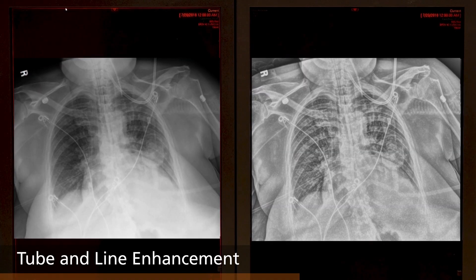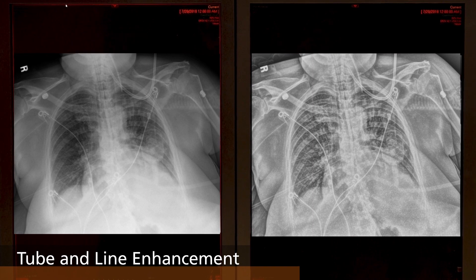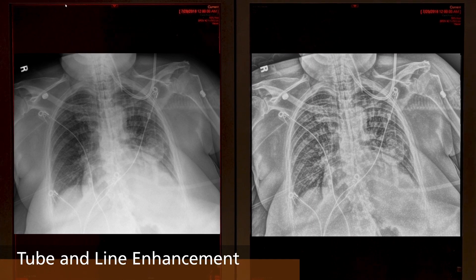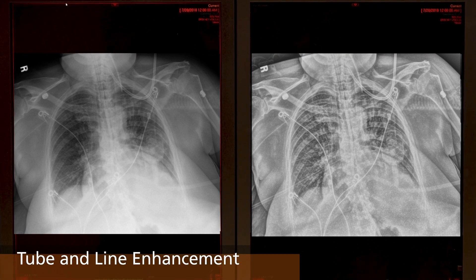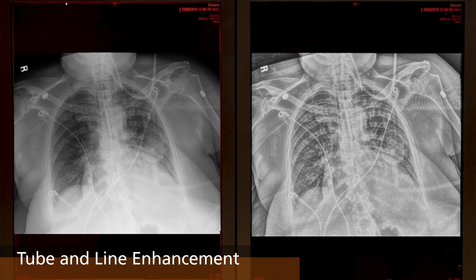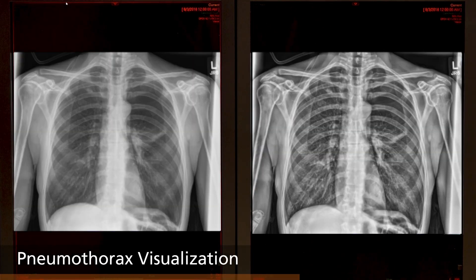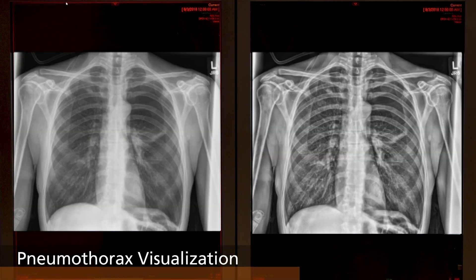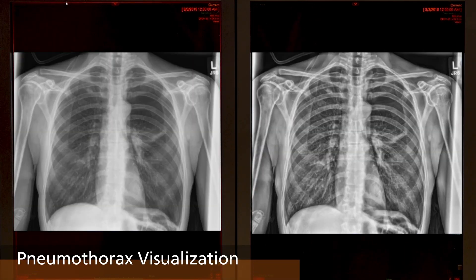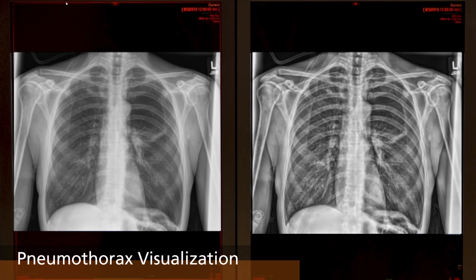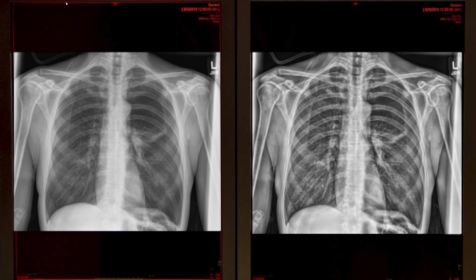Tube and line enhancement creates a companion image, as shown on the right, for improved visualization of tubes and lines. Pneumothorax visualization creates a companion image, as shown on the right, that is optimized to accentuate the appearance of free air in the chest cavity.